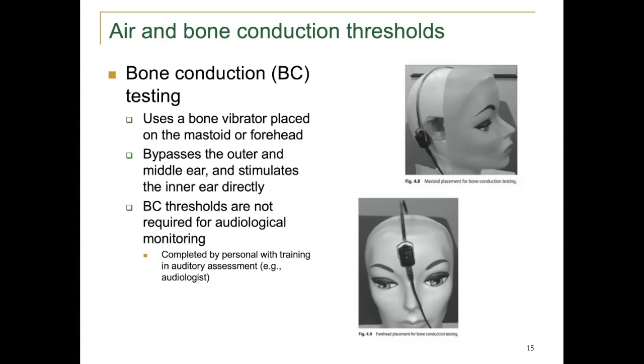Bone conduction testing is only performed by an audiologist on problem audiograms that were referred to the audiologist by the occupational hearing conservationist. So every occupational hearing conservationist, or OHC, reports to a professional supervisor, and that professional supervisor is either an audiologist or a physician.